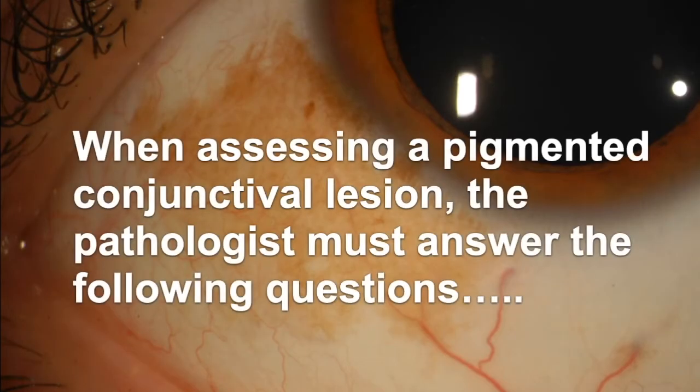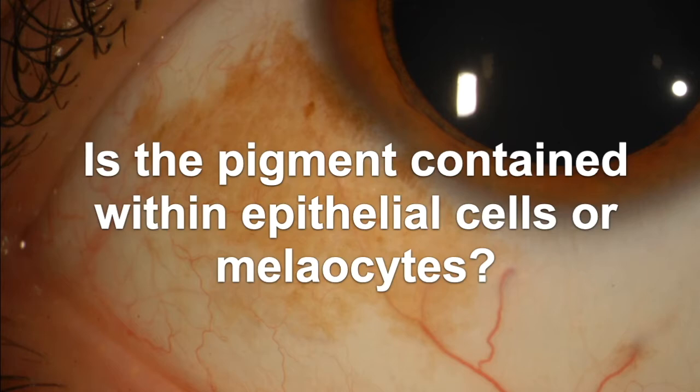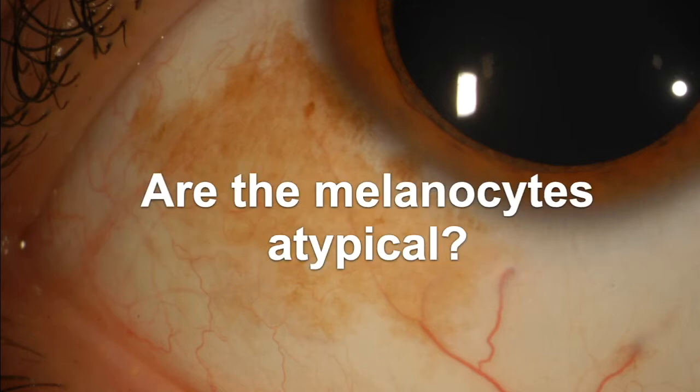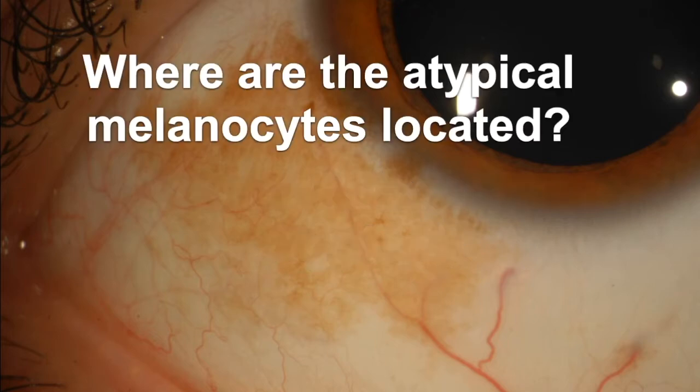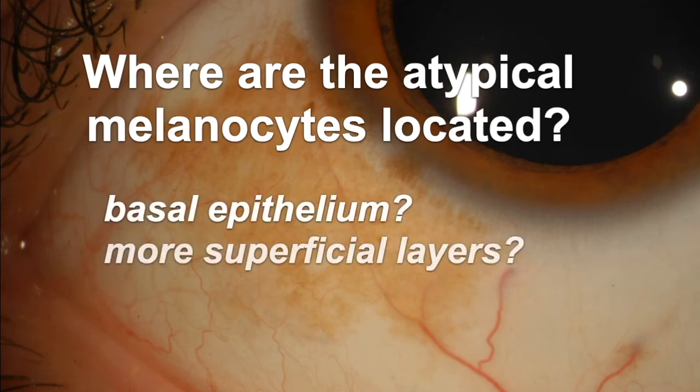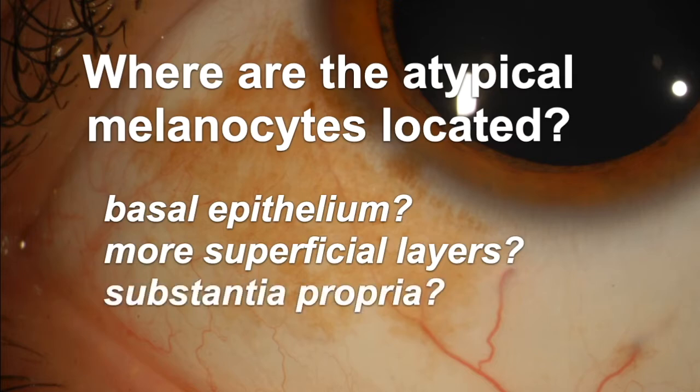When assessing a pigmented conjunctival lesion, the pathologist must answer several questions. Is the pigment contained within squamous epithelial cells or within melanocytes? Is there an increased number of melanocytes? Are the melanocytes atypical? Where are the atypical melanocytes located? Are they confined to the basal epithelium, or do they involve more superficial layers? Have they extended into the substantia propria as invasive melanoma?